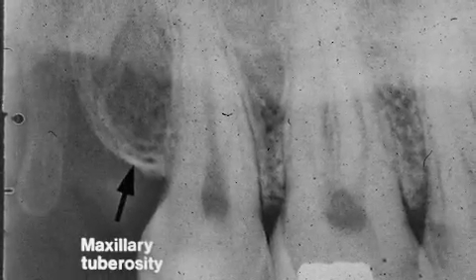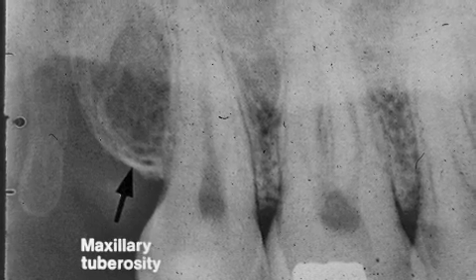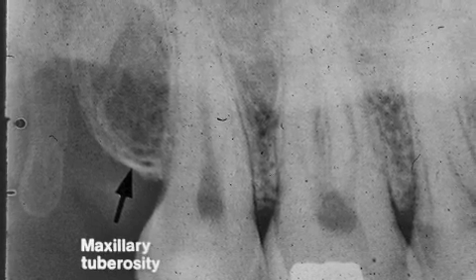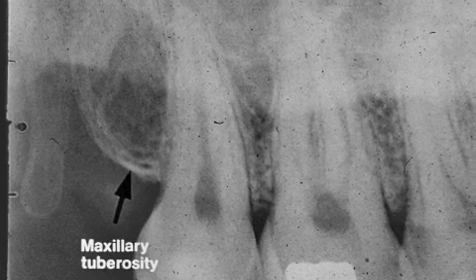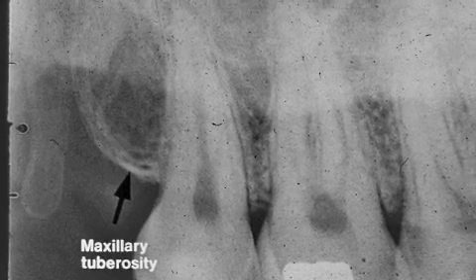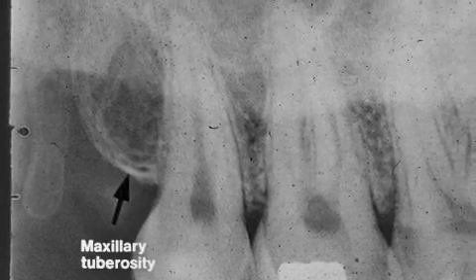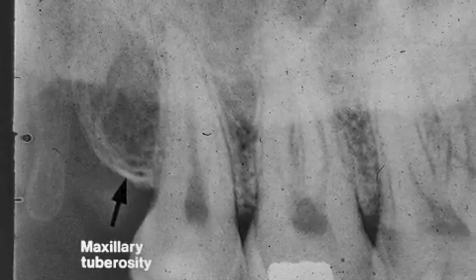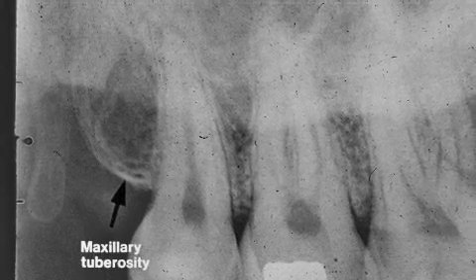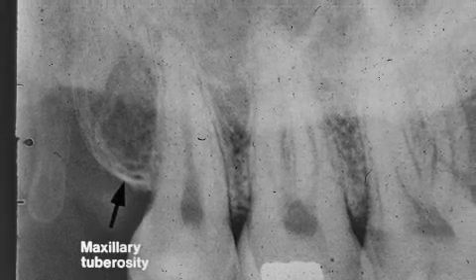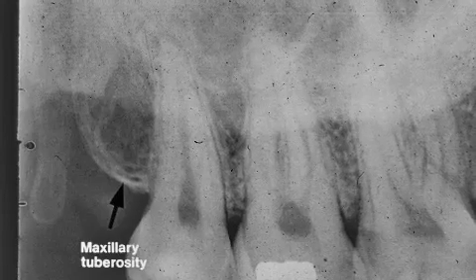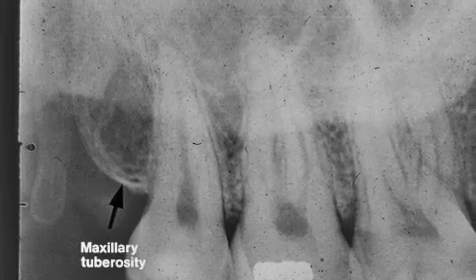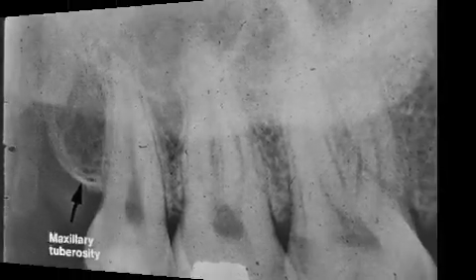The arrow points to the maxillary tuberosity. It curves upward behind the last molar. Posterior to this tuberosity, you can see an extension called the hamulus. It is an extension of the sphenoid bone, sometimes called the pterygoid hamulus. They are radiopaque.